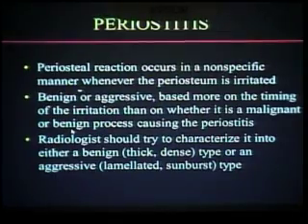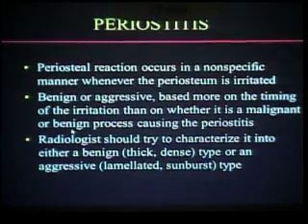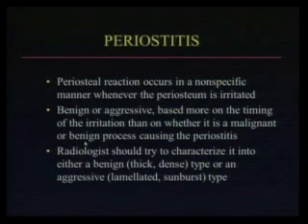Benign or aggressive periosteal reaction is related to time. If the lesion is a slow process, the periosteum will deposit calcium, and you will see a solid pattern. If there is no time, and the lesion is very aggressive, there is no time for the deposition of calcium, and you will see other patterns. Okay? Very good. So you have to try to differentiate a thick benign periosteal reaction from the aggressive pattern.